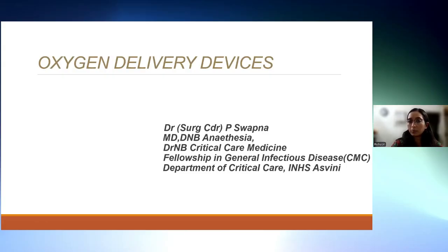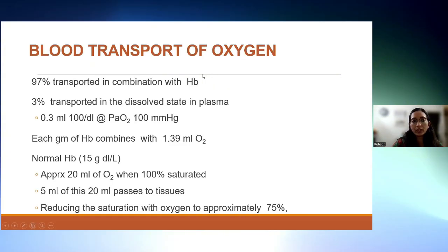The topic that is being given today is oxygen delivery devices. I hope my slides are moving. Yeah. So before we go into the delivery devices, let us just see a little basic about oxygen, and then we'll go into the topic much better.